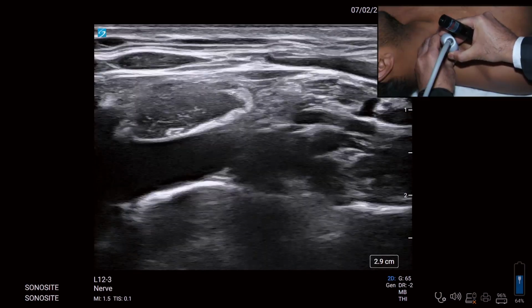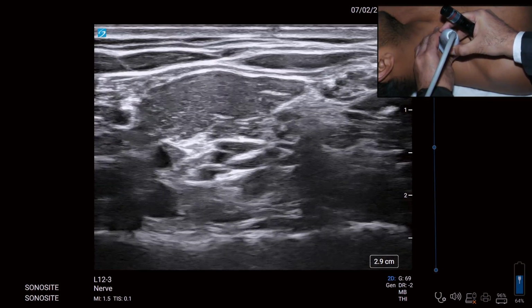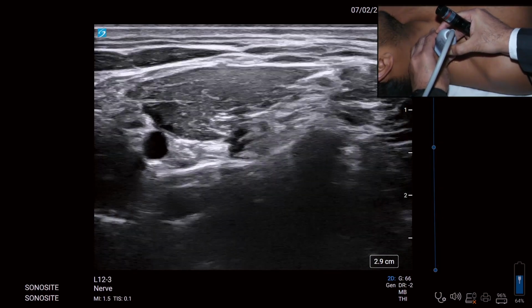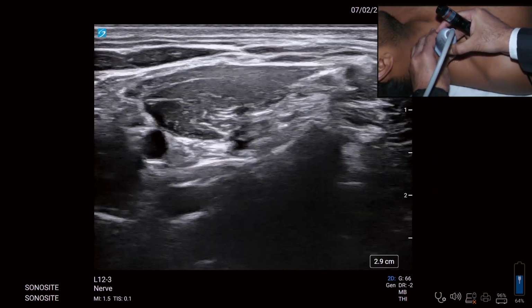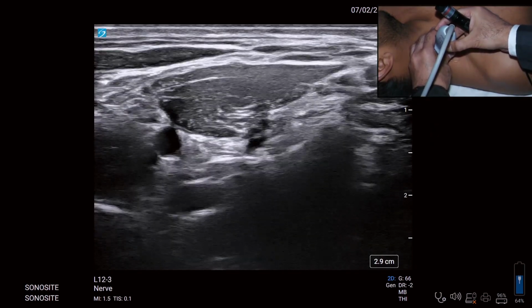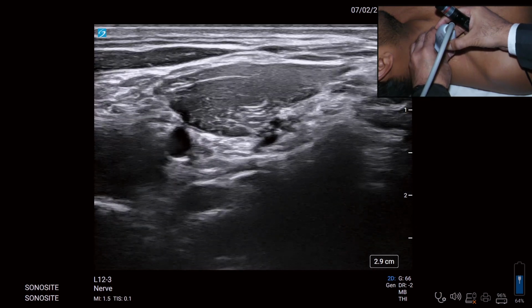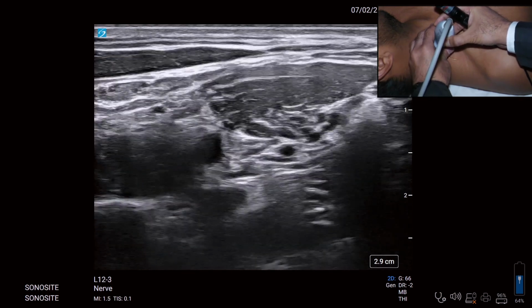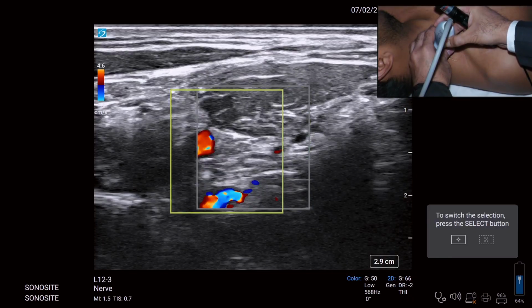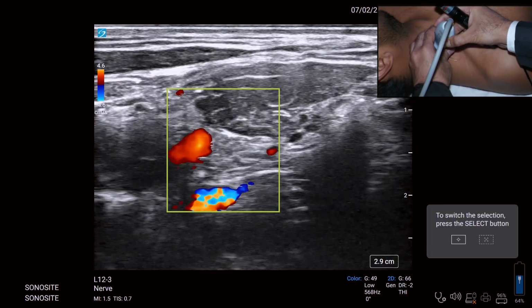As I keep going up, gain a little bit higher, friends. Yes. So can you identify C7? Any doubt? Manisha will keep pointing. C7, left hand of the screen is medial, my dear friends. Okay. On the medial side, can you switch on the color, please? Can you see the vasculature? What is that? The vertebral artery and the vein.